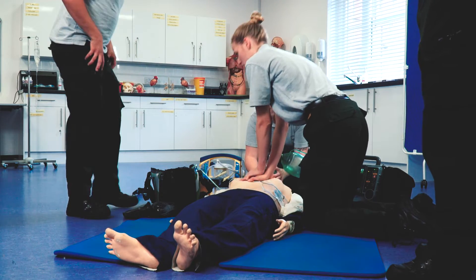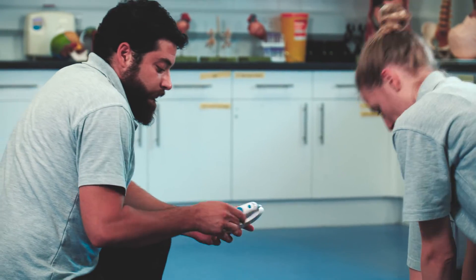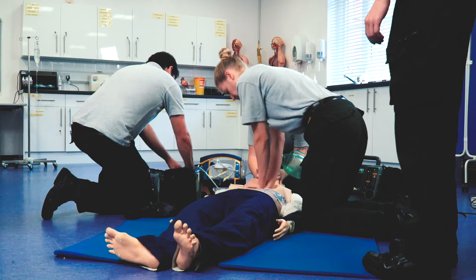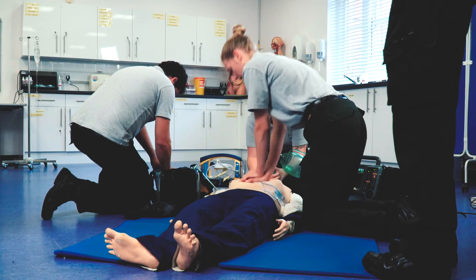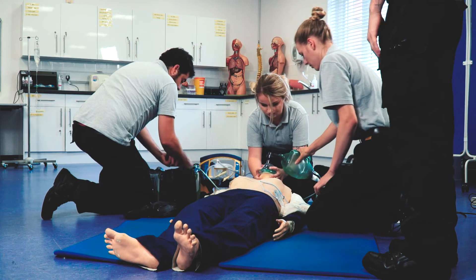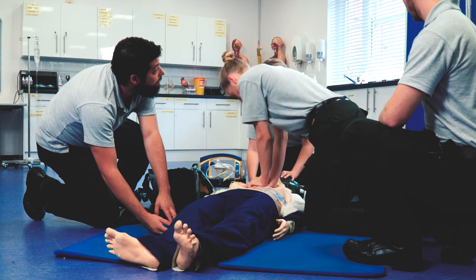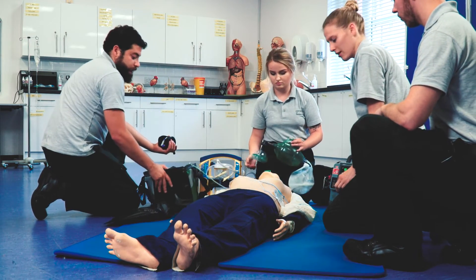Can you start IVs? Get temperature, and we'll try. Temperature is 37.2. So this is my fifth cycle — I'll do the rhythm check and shock if need be, then you take over. I'm coming in from your left. Three, two, one. Ventilate. So we're still in VF — shockable rhythm — I'm charging. Blood glucose is 4.6. Everyone stand clear. Oxygen away. Shocking.